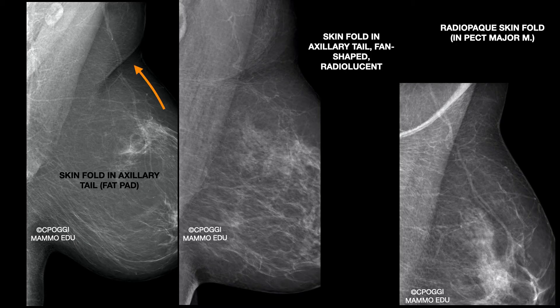This fold is due to a fat pad, not easily removed, and not necessarily correlated to a high BMI. Here you can see a fan-shaped fold, radiolucent, not so influential on the radiologist's performance.